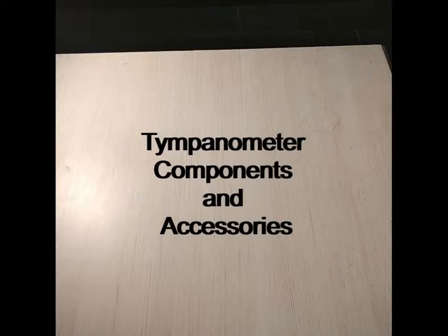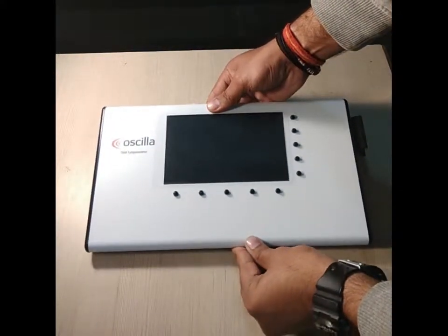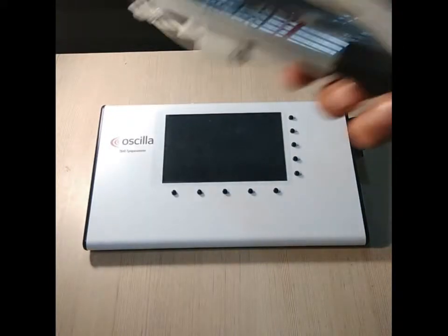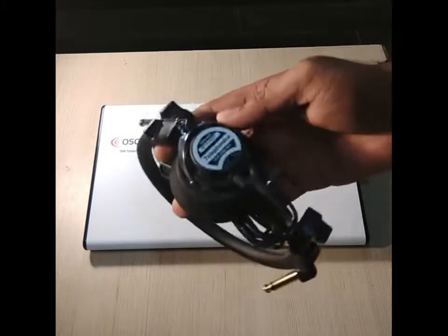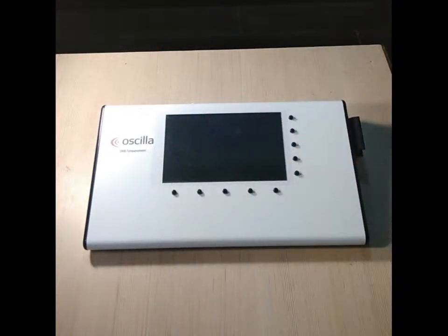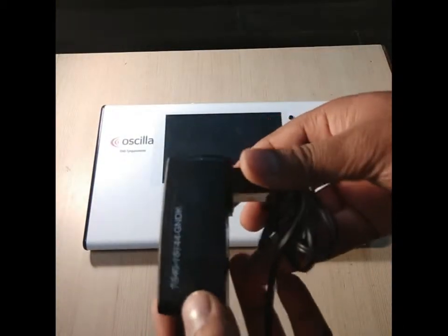Here we have the model T840 of the tympanometer, what we offer from Lavab. This is the probe of this tympanometer. It has an additional feature of contra reflex, which is why it comes with a TDH headphone. Here we have the power adapter of the tympanometer — the model number is written on it.